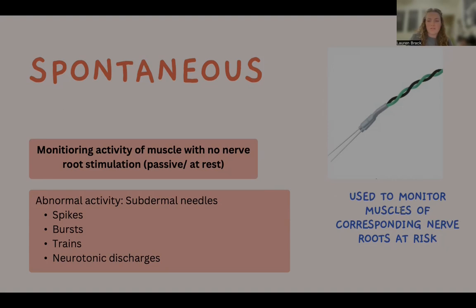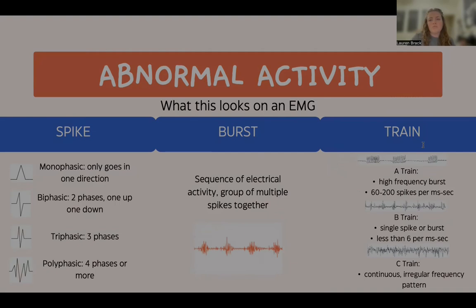Abnormal electrical activity observed during spontaneous EMG can take several forms, including spikes, bursts, trains, and neurotonic discharges. This shows what these different abnormalities can look like on an EMG. Spikes are short, sharp, high-amplitude bursts of electrical activity. Spikes can occur due to the touching or manipulation of the nerve.